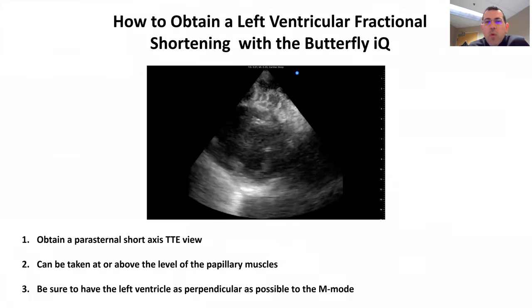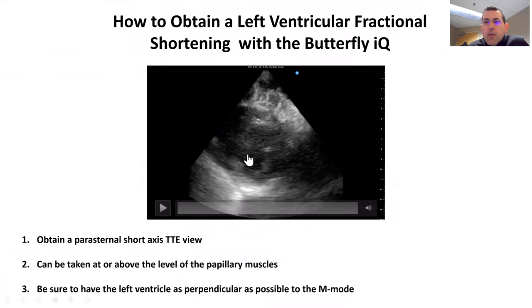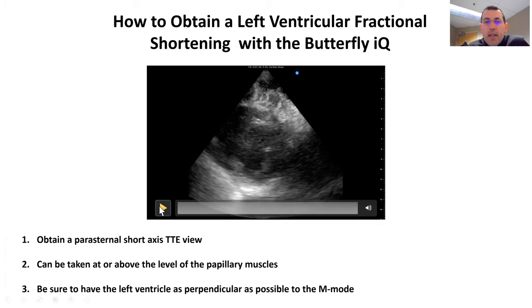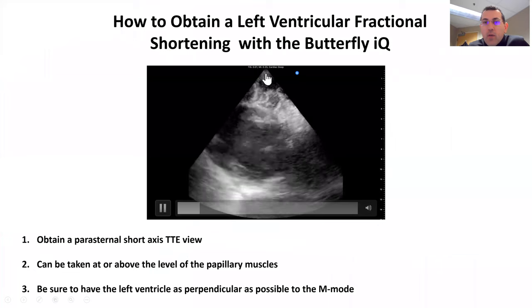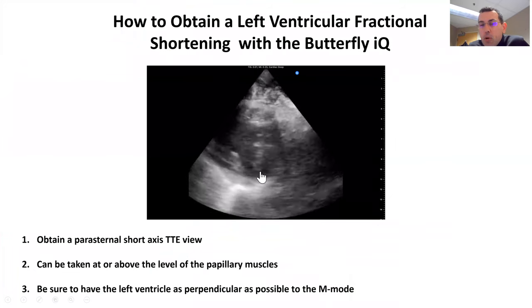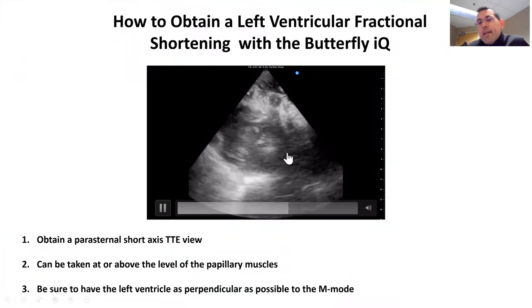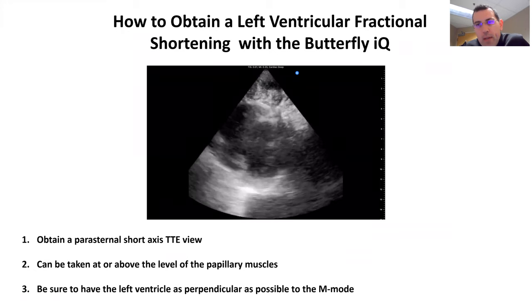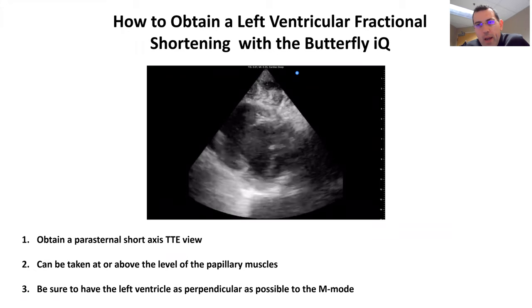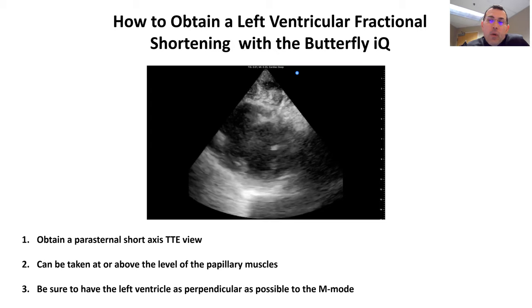The first thing we want to do to determine ejection fraction with the fractional shortening method is to get a parasternal short axis view. Here I show you a typical parasternal short axis view. Intentionally, we don't show you the best parasternal short axis view we've ever gotten — that's because we're critical care doctors. Oftentimes we can't get the best views in the ICU for numerous reasons: patients on the ventilator, they can't position.